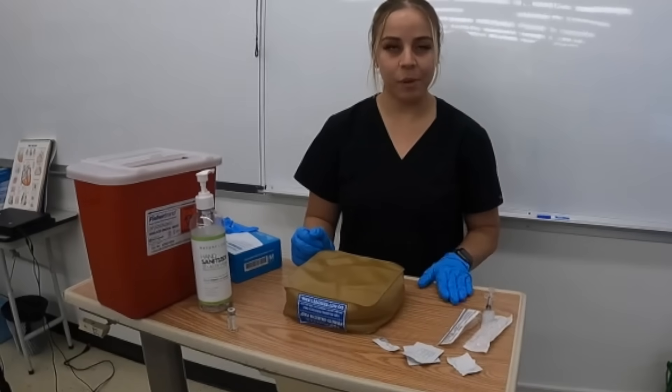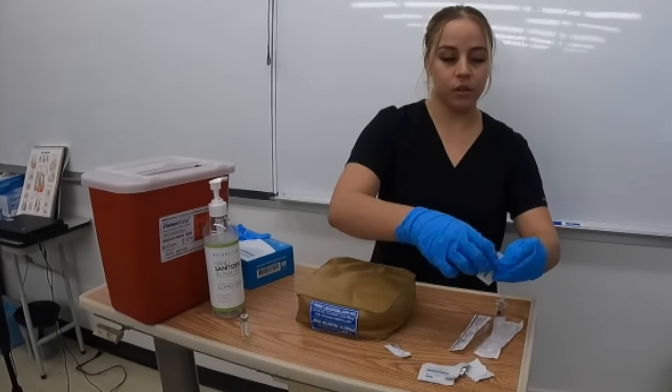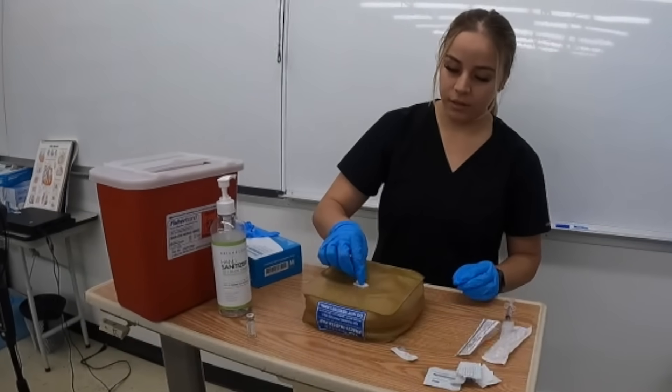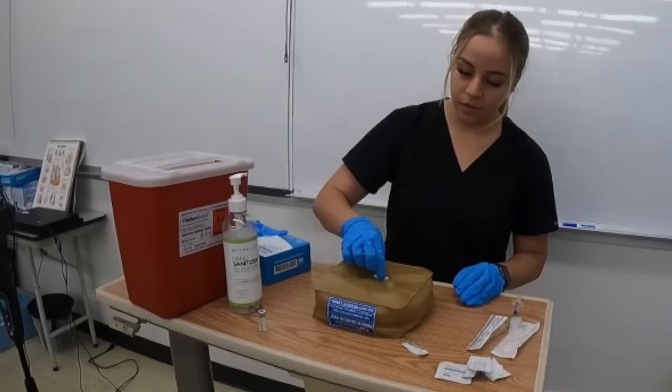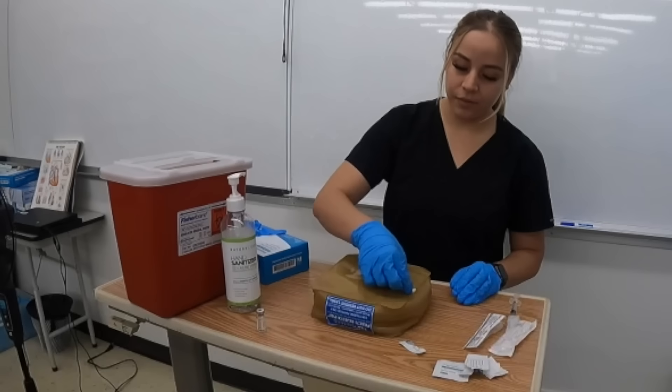Now that I have all my medication drawn up, I'm going to prep the patient. I'll open up my alcohol swab and cleanse starting in the middle and moving outward.